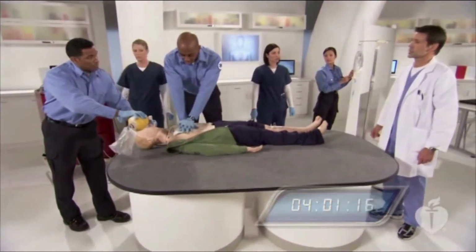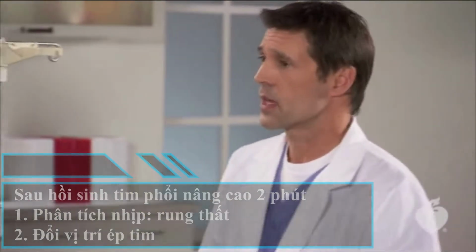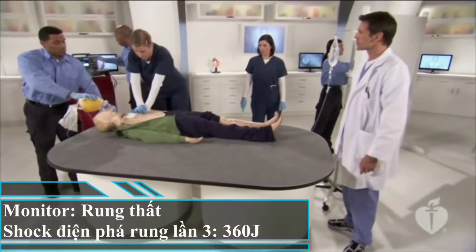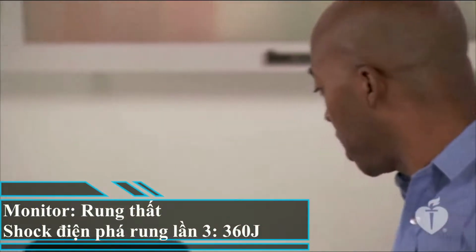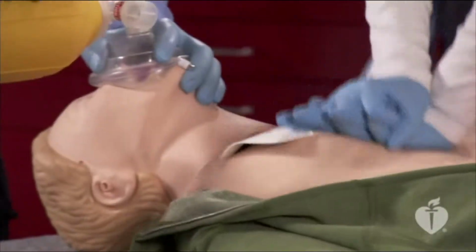2 minutes. Okay, let's analyze. Switch roles. Okay, the patient is in persistent VF. Let's shock again at 360 joules. Charging at 360 joules. Shock ready, clear the patient. Shocking on 3. 1, 2, 3. Shocking. Shock delivered. Continue CPR. Continuing CPR.